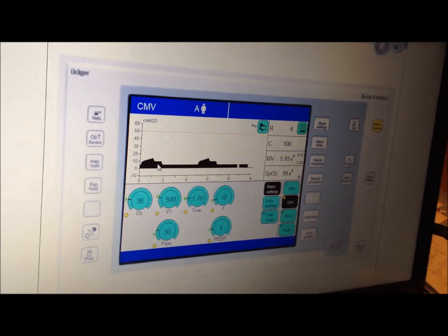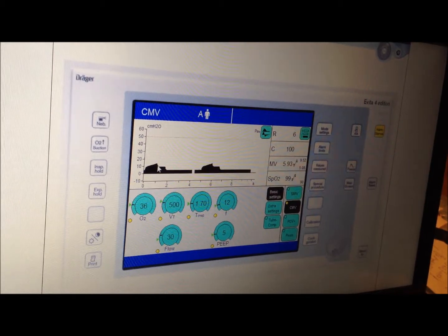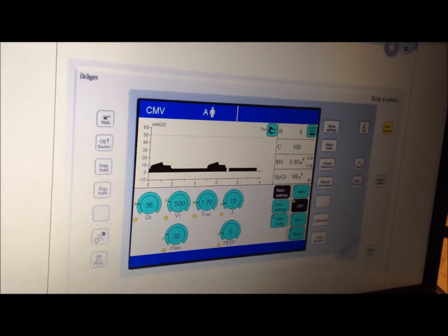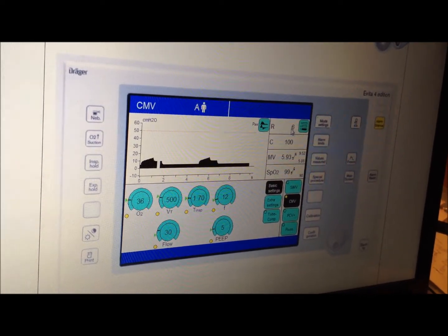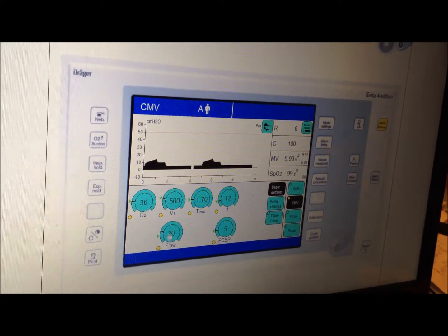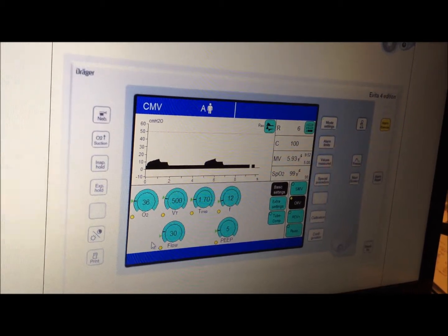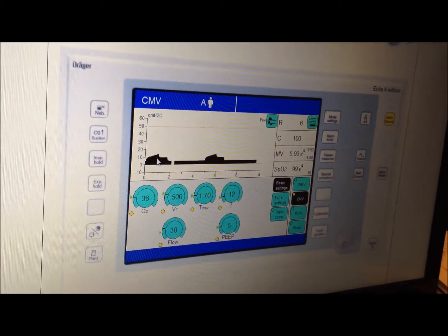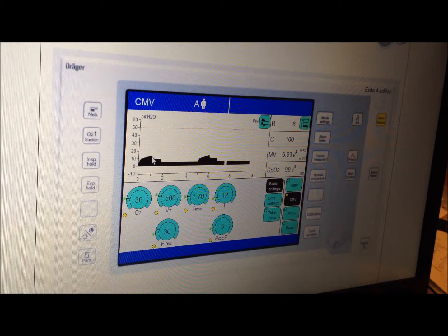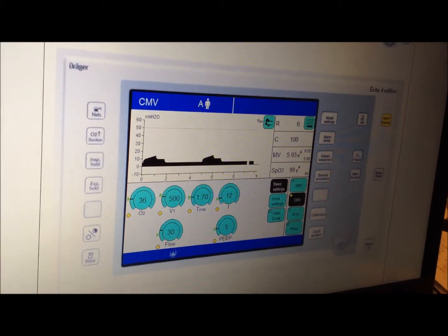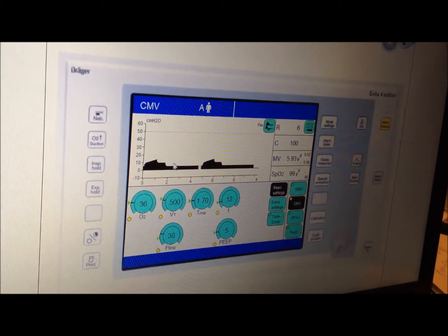Looking at the pressure-time curve: the pressure resistance equals flow multiplied by resistance. In this case, resistance is 6 cmH2O/L/s and flow is 30 L/min (0.5 L/s). So pressure resistance = 0.5 × 6 = 3 cmH2O. This patient with a resistance of 6 produces a pressure resistance of 3 cmH2O at 30 L/min.